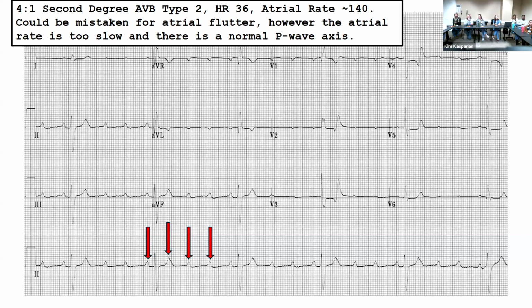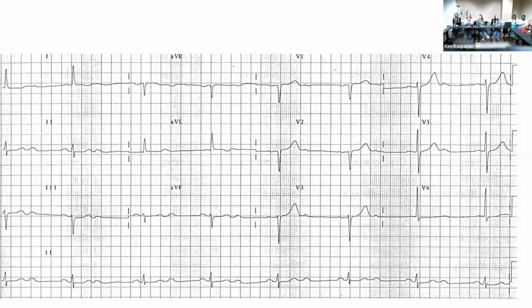But we'll just say that I'm right on this one. All right, this is a good one. And this is one that's also not uncommon. And just in the interest of time, I'm going to breeze through this one.